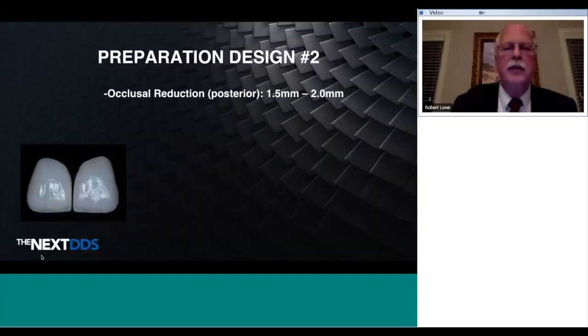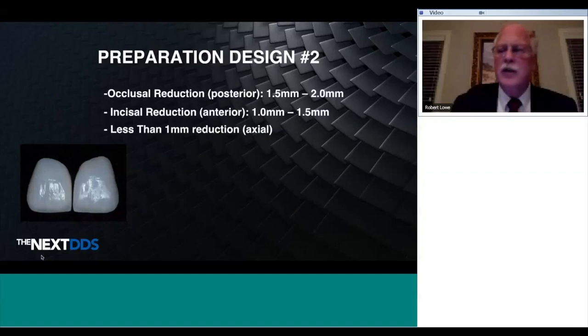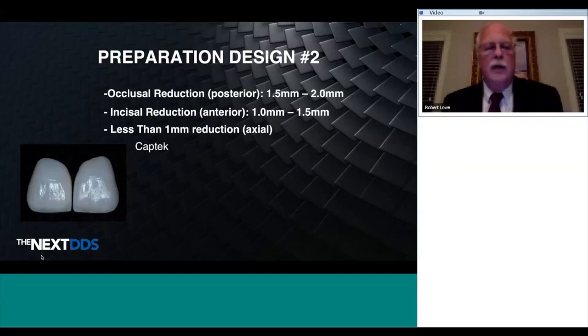Preparation design 2, occlusal reduction and incisal reduction exactly the same, the axial reduction being less than a millimeter. Captek is a porcelain fused to metal that's a specialized material because the copings are thinner and it doesn't need opaque, so it requires less space. It's also a material that has some biologic capabilities because it's been shown through studies to repel plaque because of the lower surface free energy of the composite metal.